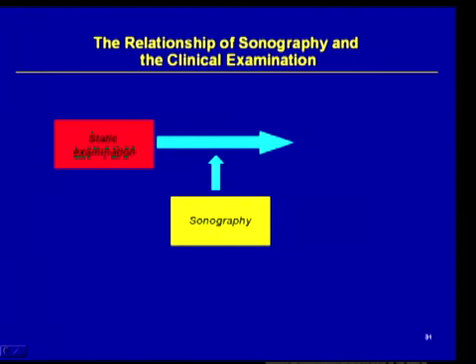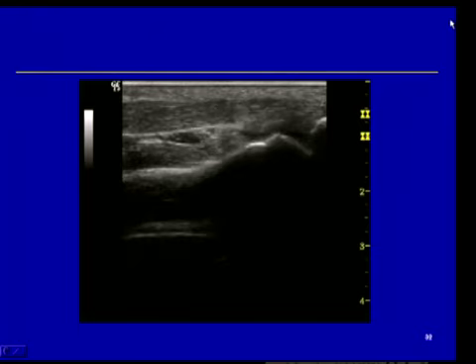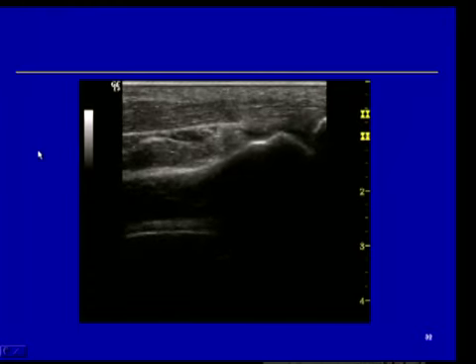The other nice thing about the ultrasound is that it takes a static examination and turns it into a dynamic examination, so we can look for things and structures that move throughout the body. Let's use a common example of something that we would see in rheumatologists. If you have a patient who complains of a trigger finger, well, what portion of the flexor tendon is indeed triggering? We can see that as we go for a longitudinal scan of the hand.